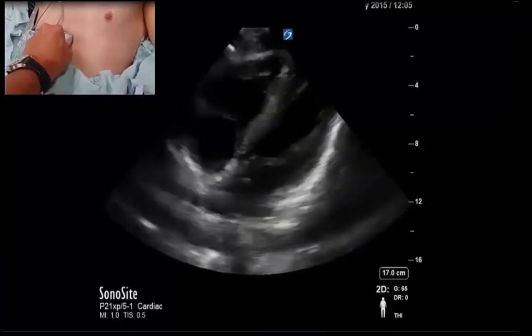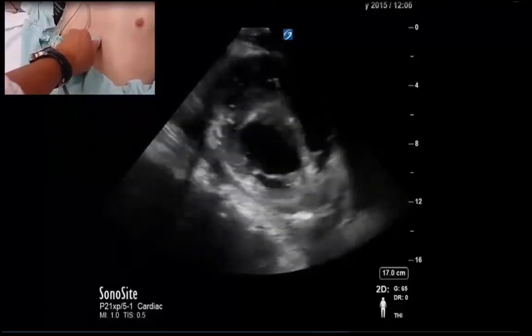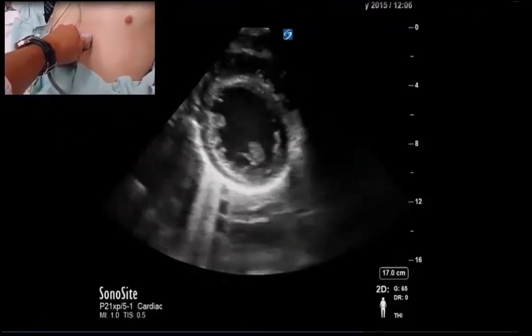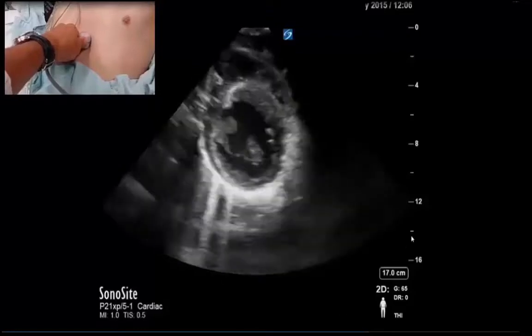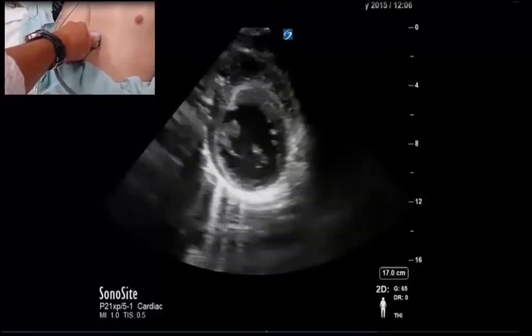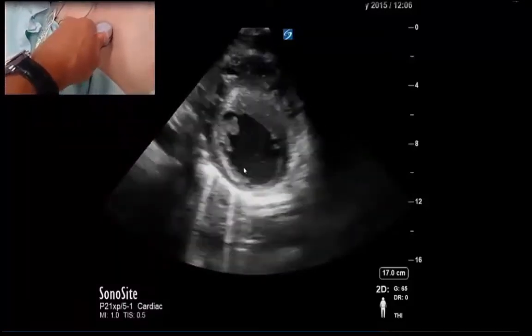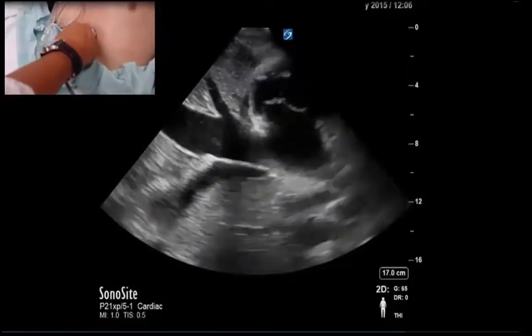We're happy with our four-chamber. We agree the LV looks sluggish, the RV looks a little dilated, and there's no meaningful pericardial effusion. What I've done here is tipped my index mark towards the patient's head, and from that position I've now captured the left ventricle in a short axis view at the papillary muscle level. This allows for a more detailed analysis of the four walls of the ventricle, and in my opinion we certainly have depressed LV function with limited endocardial excursion or thickening throughout.